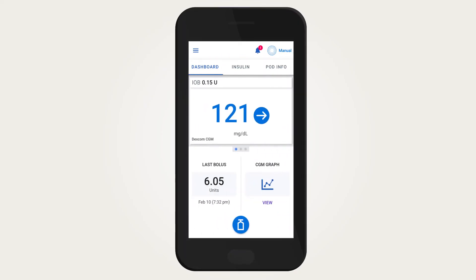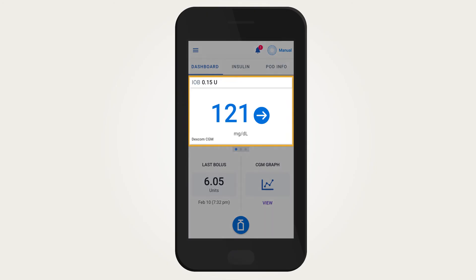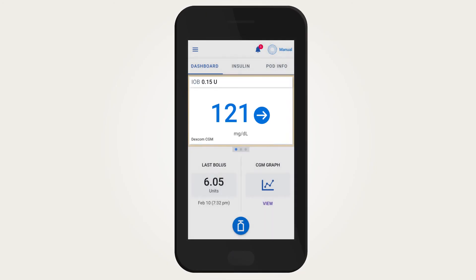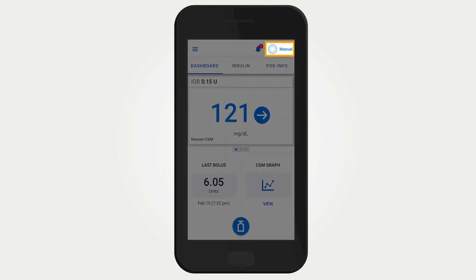If you have an active CGM connected to the Omnipod 5 app, you will still be able to see your CGM values and trends on the home screen when you are in manual mode. Be sure to check the mode indicator on the upper right side of the home screen to find out what mode you are in.